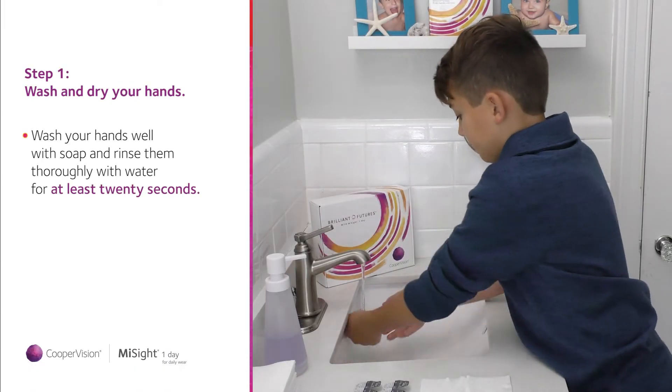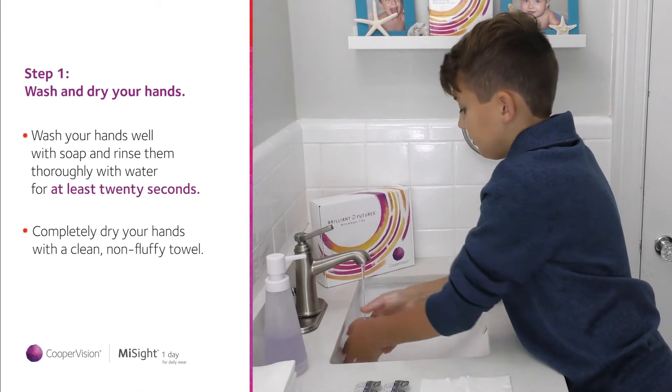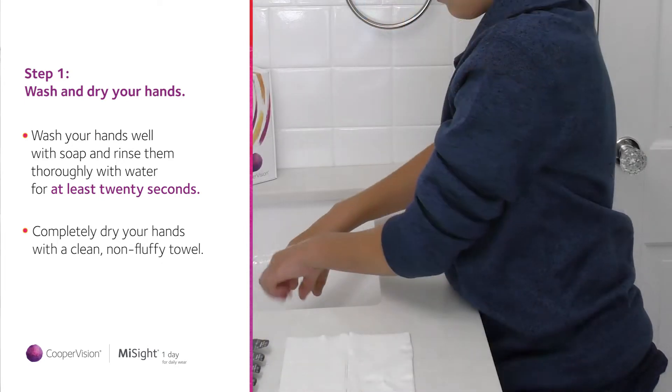Wash your hands well with soap and rinse them thoroughly with water. Now completely dry your hands with a clean, non-fluffy towel.